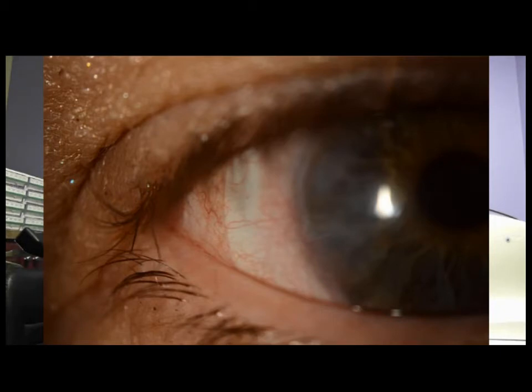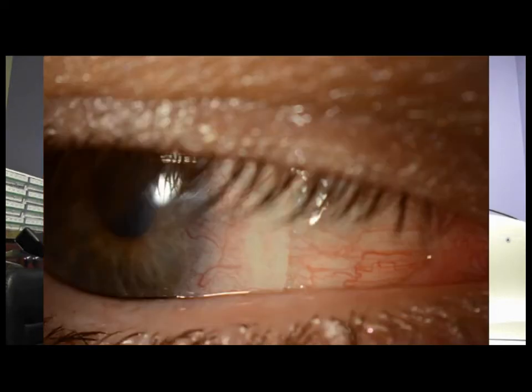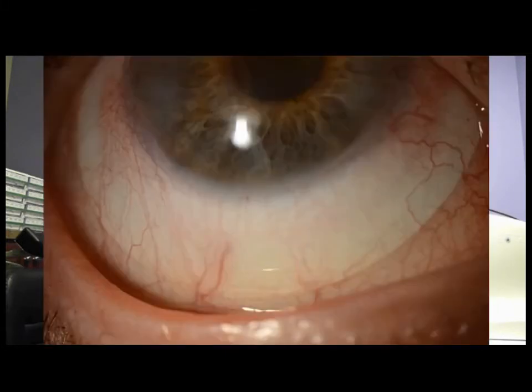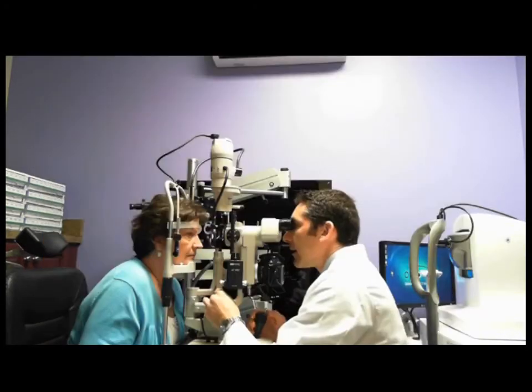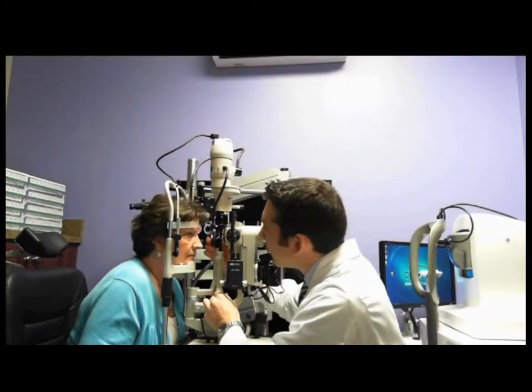Darlene, look off to the right. And look way up high. And down low. And now let's take a look at the other eye.